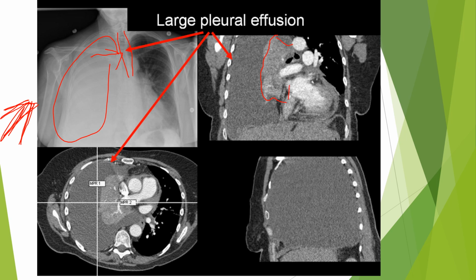Yeah, this is the outline of the lung. And then over here, here is the parietal pleura. So all this stuff in here is pleural effusion. That's pretty crazy, right? So you can actually see a lot better what the volume is too in there as well. You can see if it's a 4-liter pleural effusion or a 500 ml pleural effusion. Here, this one's pretty massive.